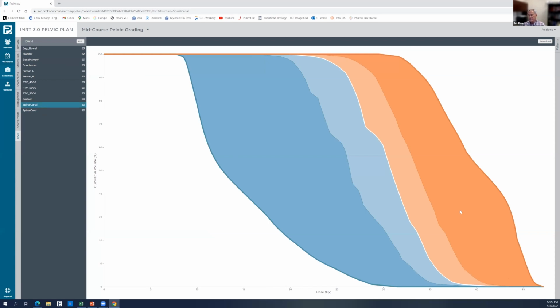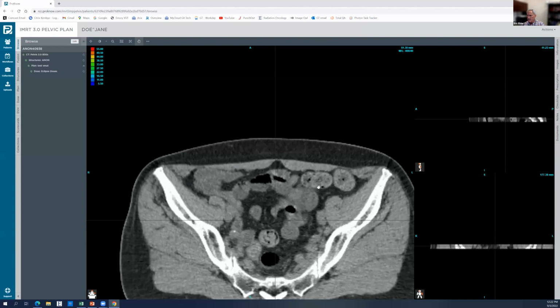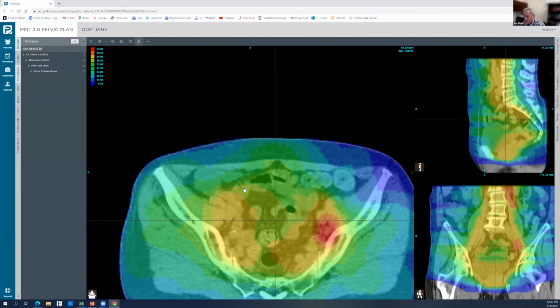You can see in this case, for the spinal cord, we're kind of pushing up on that 4,500 centigray dose. You generally want to hold the spinal cord down. We try to limit our doses at Emory using constraints to bring the dose down to about 30 gray if it involves the cord. Let's jump into an actual plan, and I'm going to pull up the one that my dosimetrist did first. I want to point out first the structures that were created.